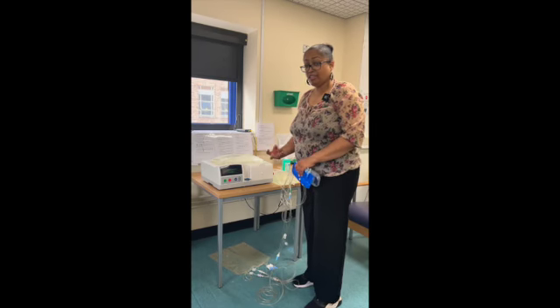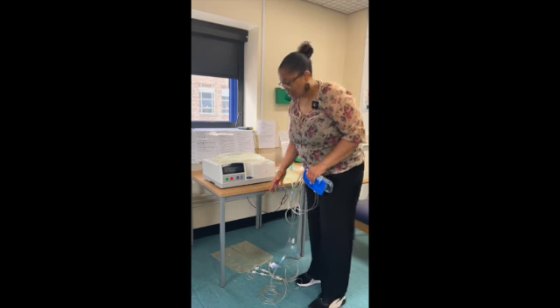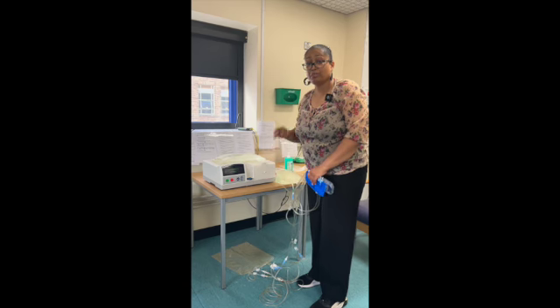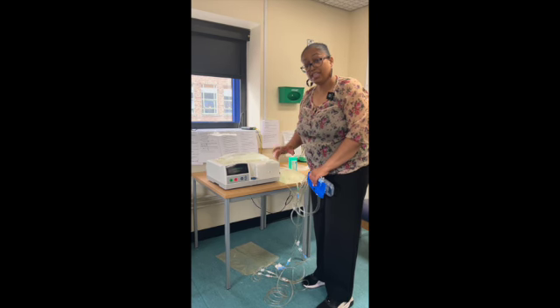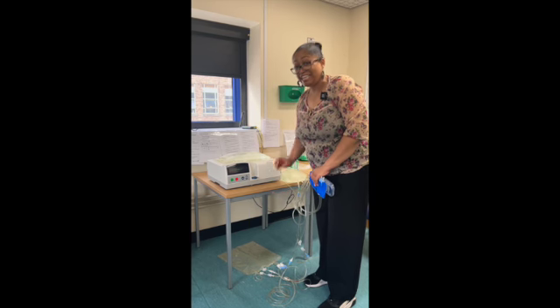So in a real dialysis session, these bags would be empty and this would be full. So I take these bags to the toilet, check them, make sure that they are clear, because I'm checking for signs of infection. If they're fine, then I can empty the contents of these bags into the toilet.